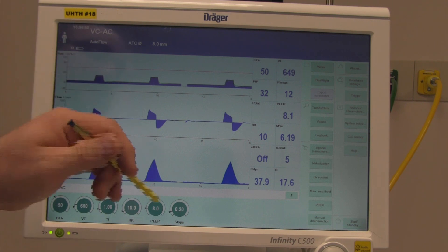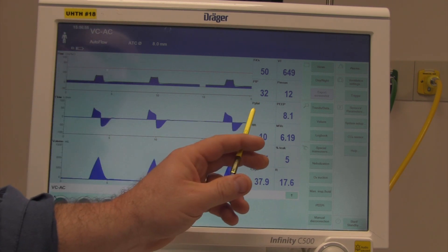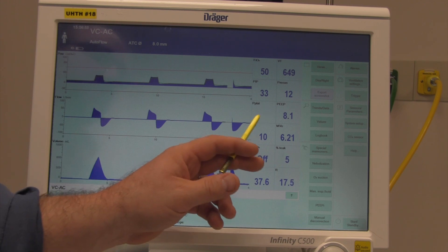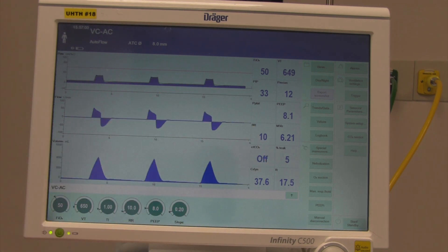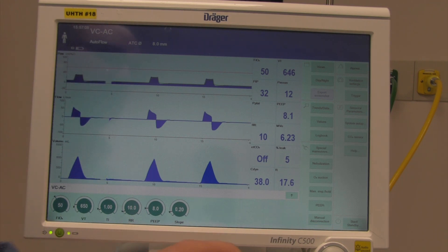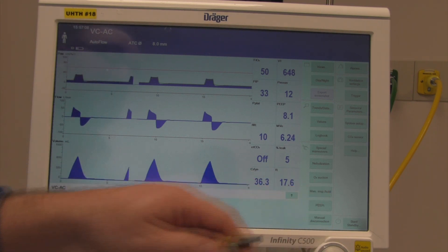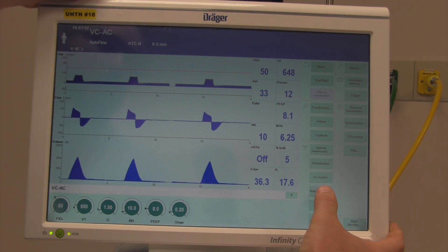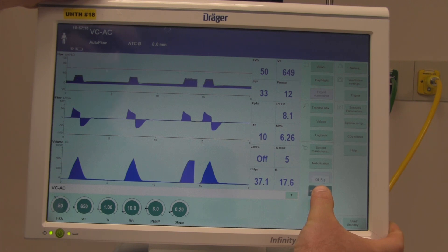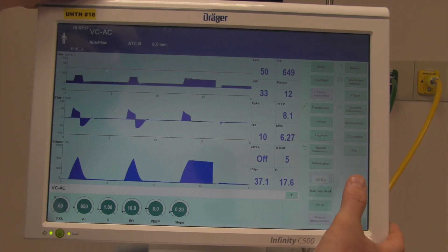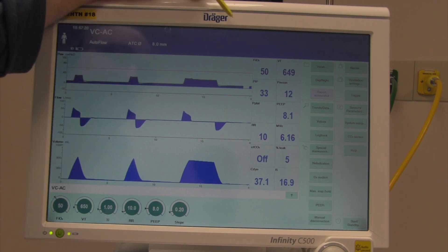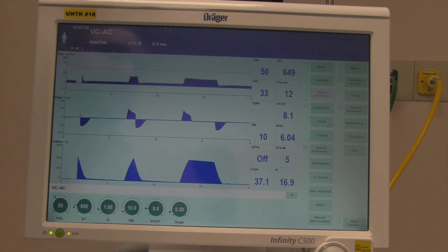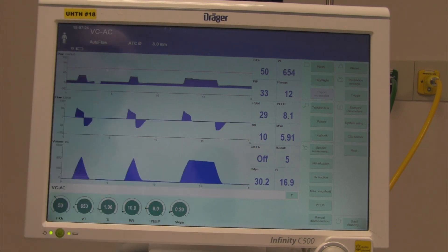Today we're looking specifically at static compliance, and to get that we need the plateau pressure. It doesn't read a plateau pressure every breath because we have to perform a maneuver called a manual inspiratory hold. When I press this button, it takes a breath in and holds it — hold, hold, hold — let off, that was 3.6 seconds.